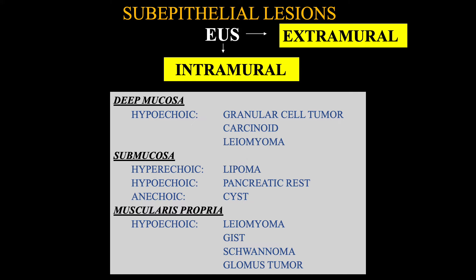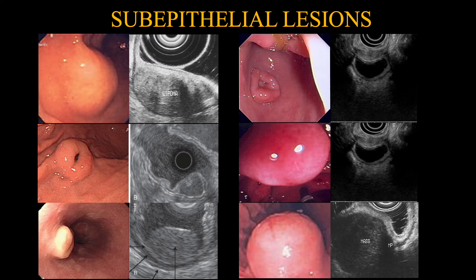As with deep mucosal lesions, all lesions originating from the muscularis layer are either a leiomyoma, GIST, schwannoma, or a glomus tumour. All these images of lumps and bumps have verified pathology.